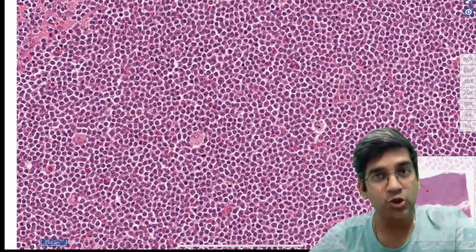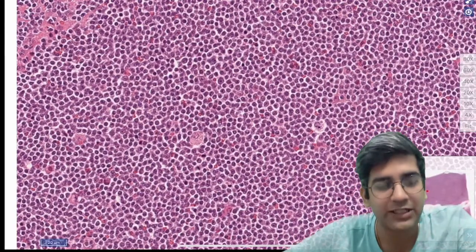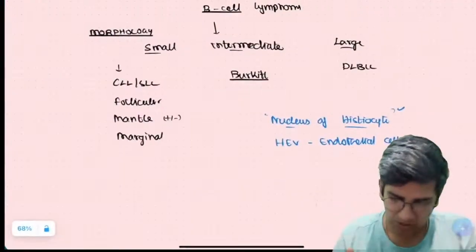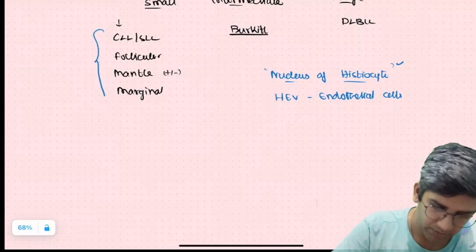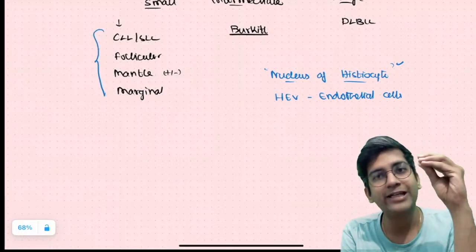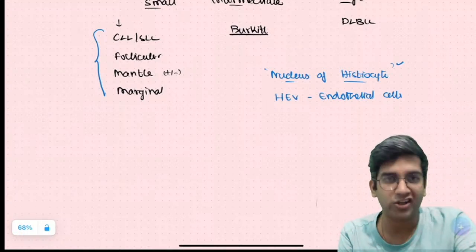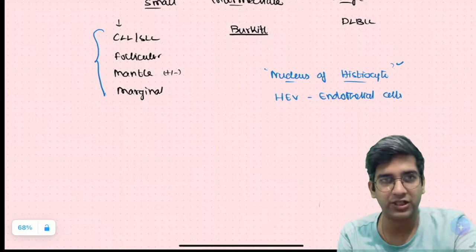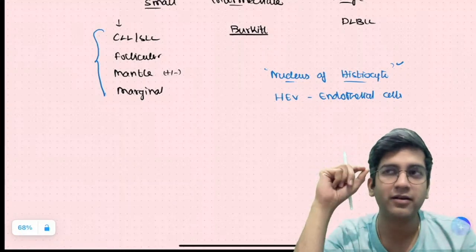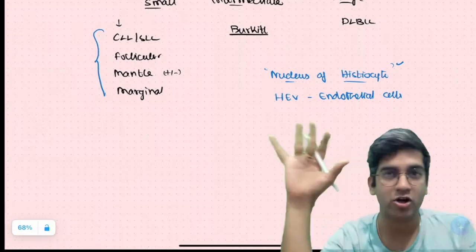Like I said, assuming that the predominant lymphomas come under B-cell lymphomas, that's why I'm saying it looks like a small lymphoid neoplasm by default. Fine. Okay. Now let's go to these four. So now what do I look for so that I can pinpoint and say most likely it could be SLL, most likely it could be follicular, most likely it could be mantle and marginal? Okay, just one or a few points. If your college has case slides, go and have a look at them and see if these points are visible or not first.